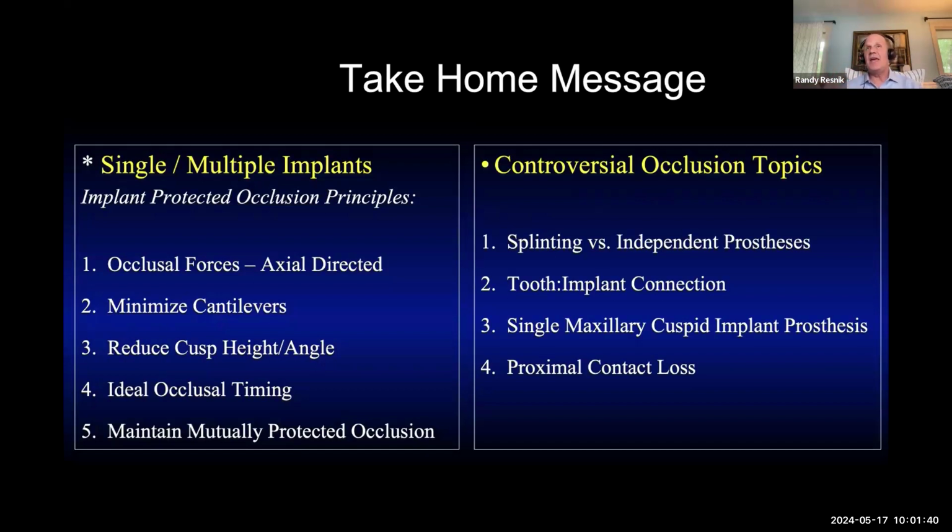Tooth implant, you can do it. However, it should be in compromised situations, not on a routine basis. Maxillary cuspid implant, you want a short disclusion. And proximal contact loss, it does happen. It's probably the most common prosthetic complication now in the literature.